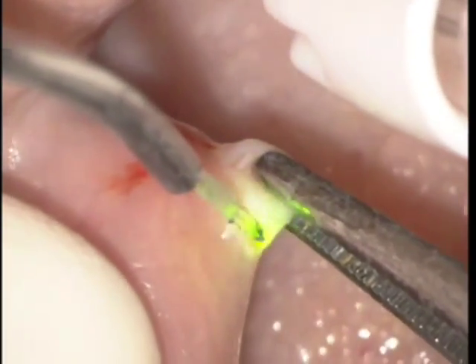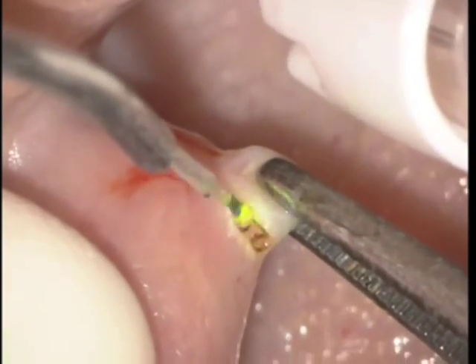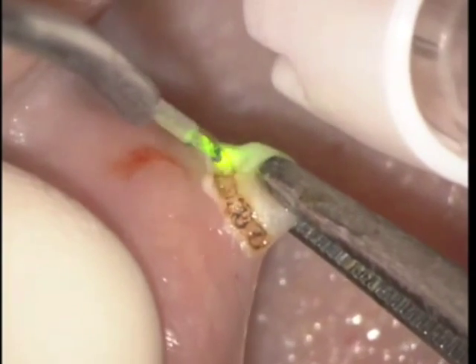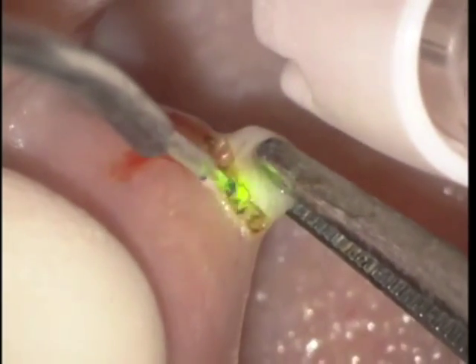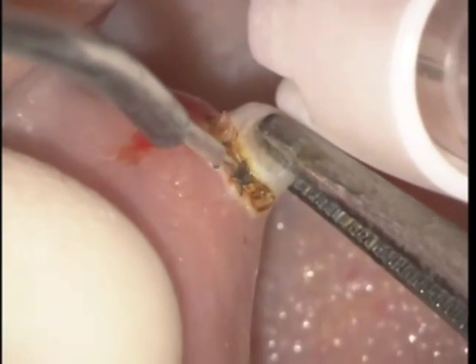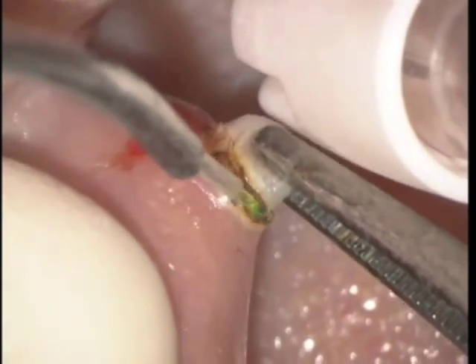In this video you can see that the pulsing of the laser is picked up by the video on the scope and you see that as green pulses. You have to let the laser work — let the light work — so you move in slow, brush-like strokes.